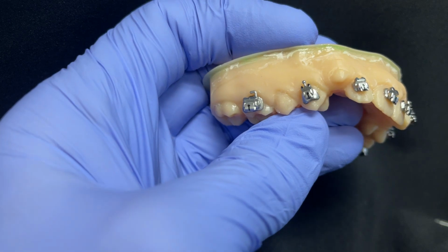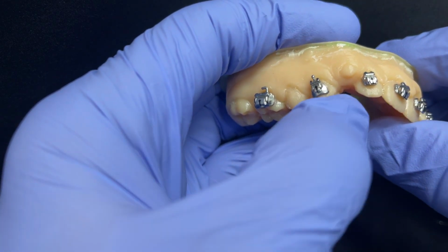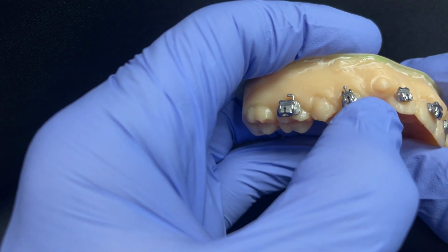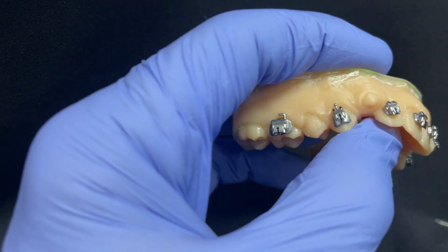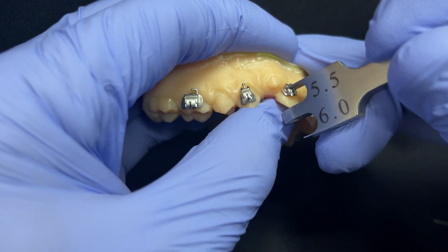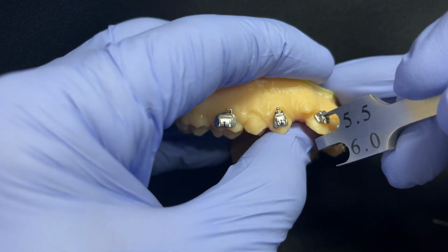I'm okay with that. That just means that this lateral incisor needs, relative to that 4, okay, remember, if the maxillary first premolar is at 5 millimeters, then the cuspid needs to be at 5.5, and then the lateral incisor also needs to be at 5.5. So let's look and see if we have that, and we don't quite have that, so we're going to move that up to 5.5 there, and now we do. Boom. Okay, it looks like we're missing a little adhesive there. I'm going to scooch this guy over and readjust here at 5.5.